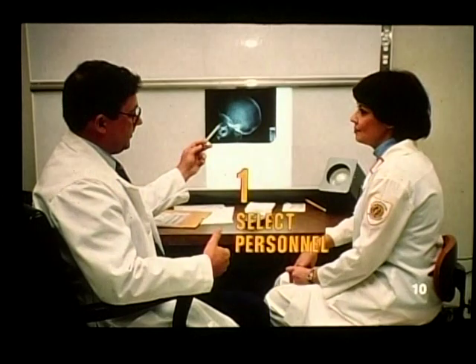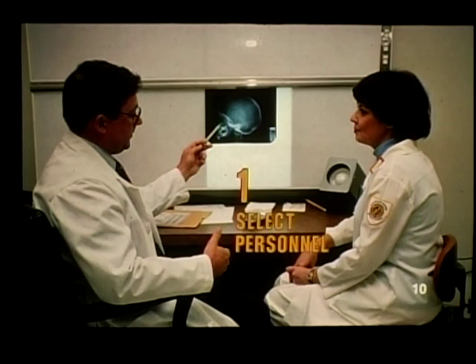Number 10. The first step in establishing a quality assurance program is determining how it is to be administered and who is to be responsible for making it work. In terms of overall responsibility, the Joint Commission on Accreditation of Hospitals states that the radiologist director of the radiology department is responsible for the maintenance of a quality control program. The Bureau of Radiological Health recommends that the owner or practitioner in charge of the facility has primary responsibility for implementing and maintaining the quality assurance program.